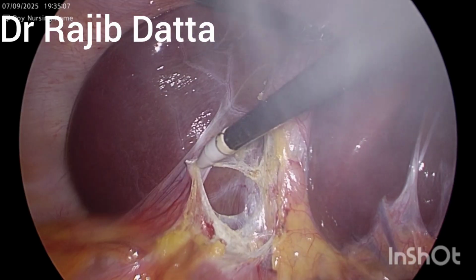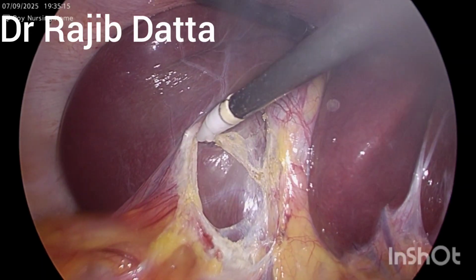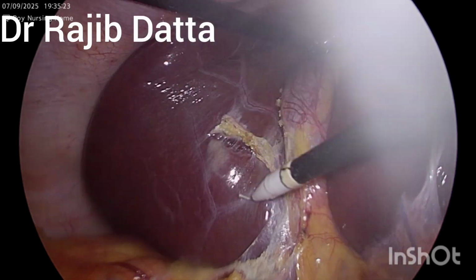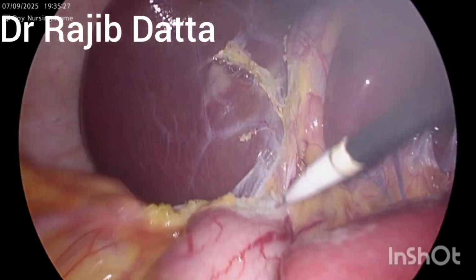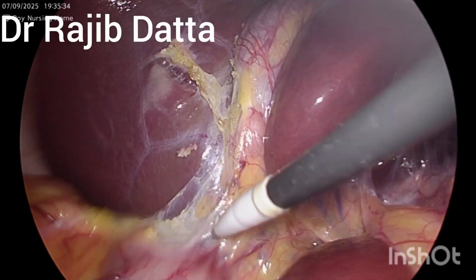So both the blunt and the sharp dissection can be simultaneously done. Now adhesiolysis from the liver bed is going on. So adhesiolysis is almost done.